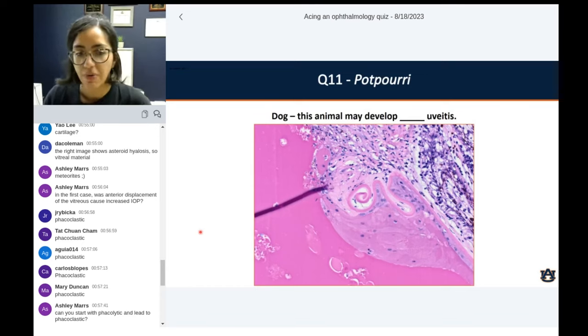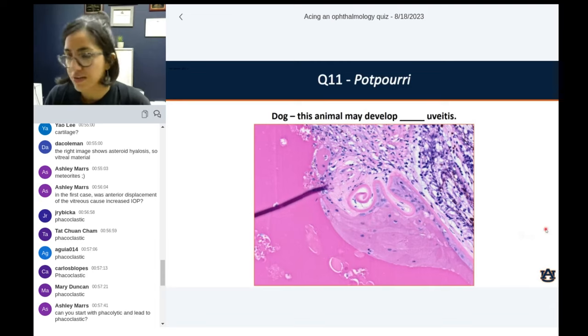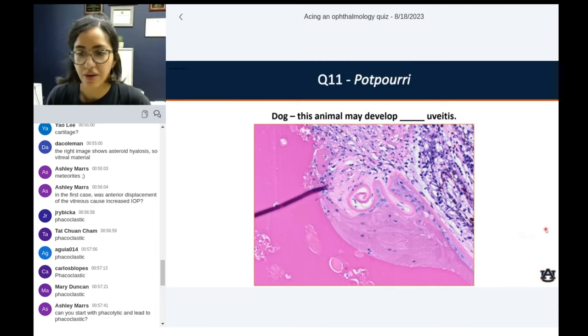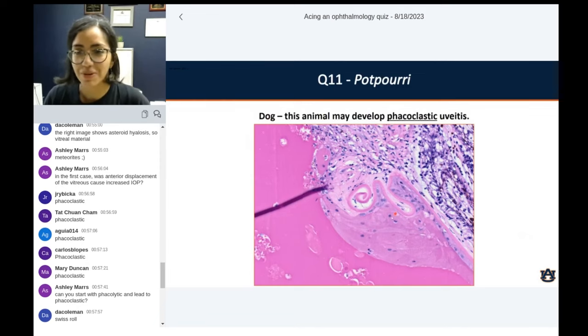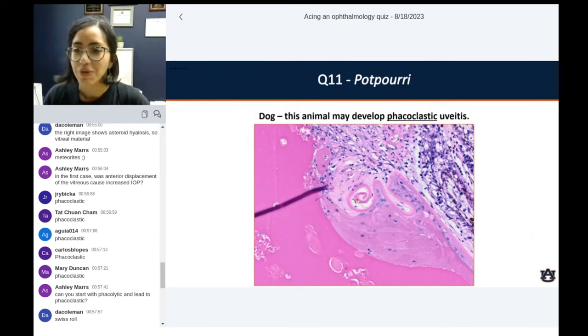We had a pretty decent trend of phacoclastic. So yes, you guys got this right. It's pretty coiled — we know there was a lens capsule rupture. These are all cataractous changes as well. This animal had bladder cell formation and morgagnian liquefaction. Most important here: lens capsule rupture predisposes for a really robust overwhelming inflammation of this eye — which is phacoclastic, usually fibrinogranulomatous or suppurative depending on the animal.